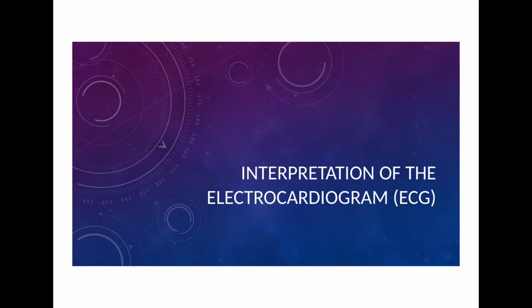Hello everyone. Today's lecture is on the interpretation of the electrocardiogram, or ECG.